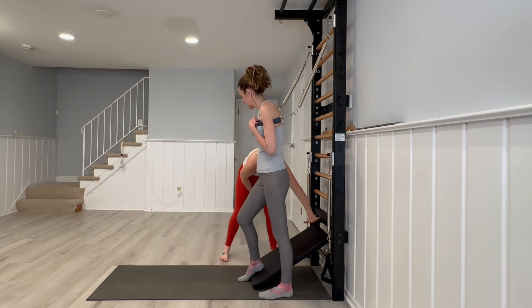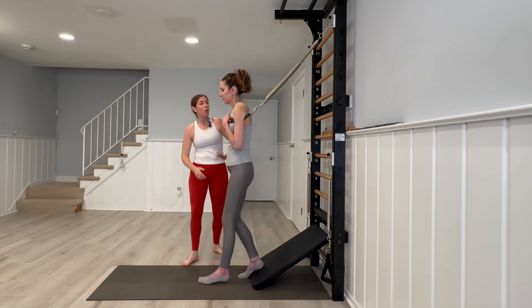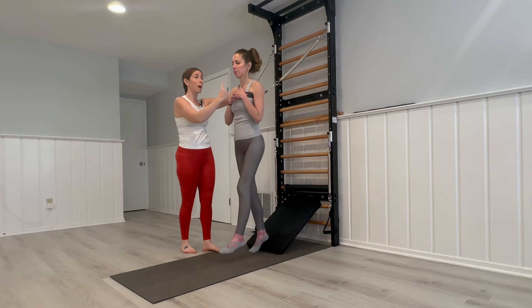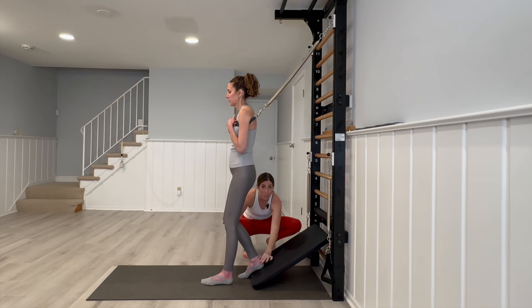We've got the slant board at number one. Mariska is going to have her back heel on and her front leg off. We also have the connector strap for upper body support. From here she's going to step up and back down, so the foot is on the back board, allowing those knees to go past the toes safely.